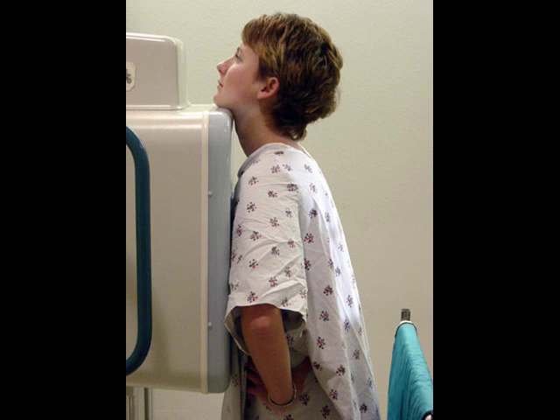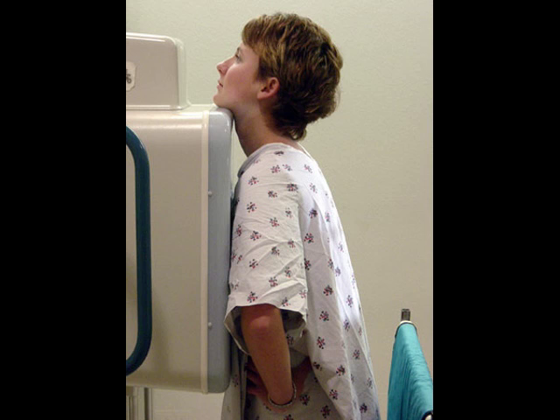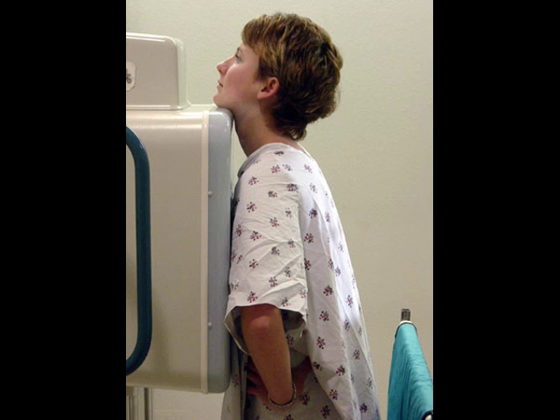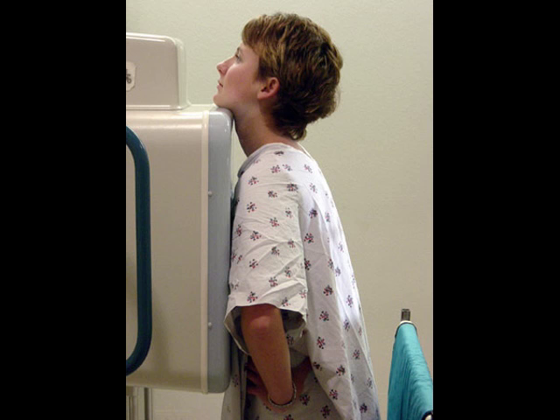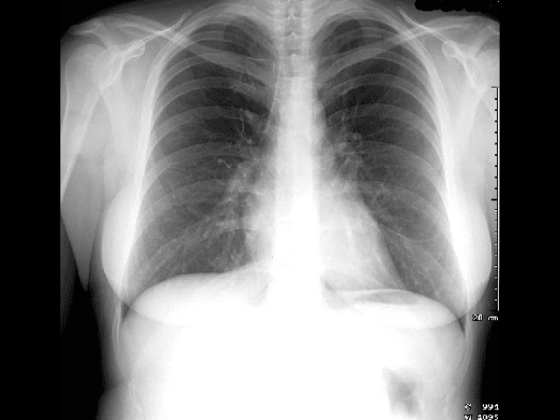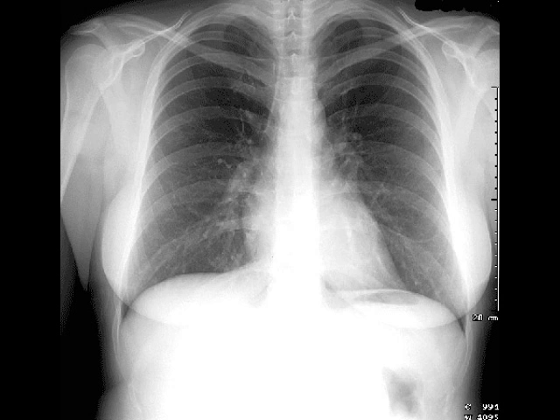When the plate is at the patient's chest, this is called a PA chest, or posterior to anterior. That's because the x-rays travel from the cathode ray tube through the back to the plate, which is at the front — so it passes from the patient's posterior to their anterior. Here's what the x-ray looks like; we'll go over different elements of this x-ray later.